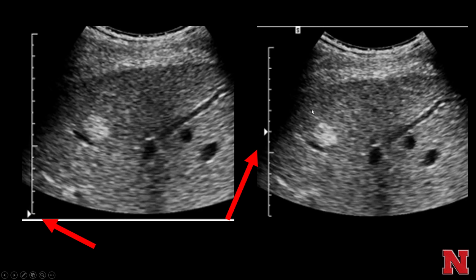Here's an example again of that echogenic liver mass where the focal zone is set deep. You can get a much better idea of the borders and the interface between the normal liver and the abnormal echogenic parenchymal lesion here if you change your focus site to the depth of the tumor.